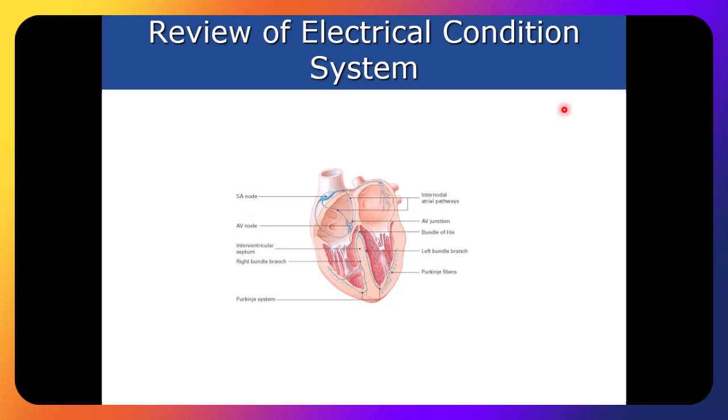What other rhythm do we look at that doesn't have any P waves that we've already covered? AFib. What's one of the hallmarks of AFib? No P wave and irregular. Grossly irregular. Your junctional rhythms will probably be regular.